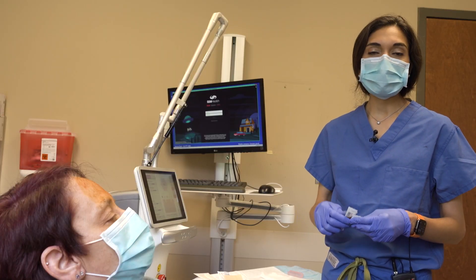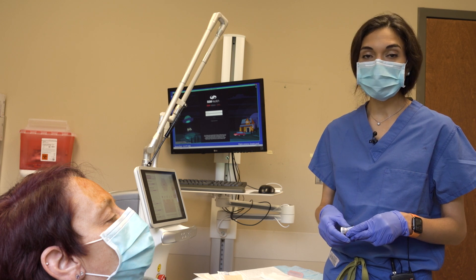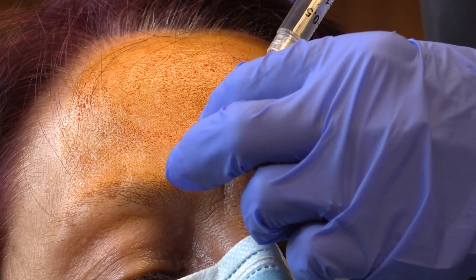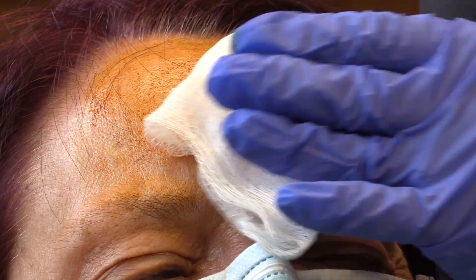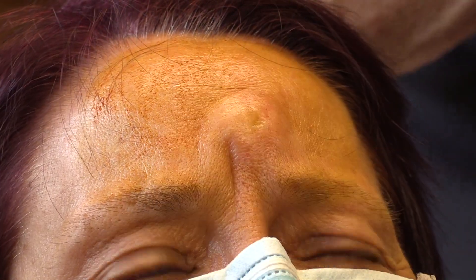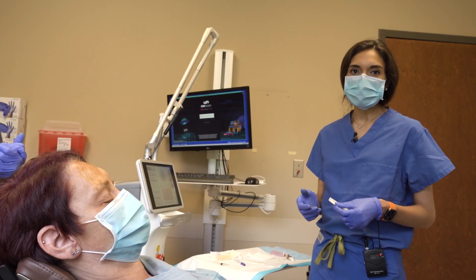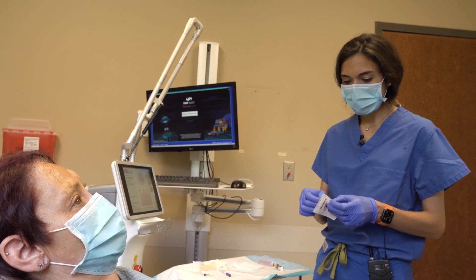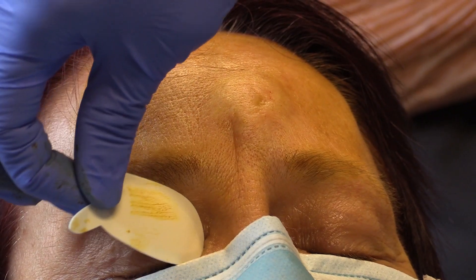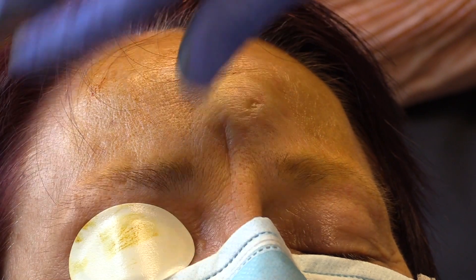The next step is to go ahead and numb the skin, which is required for the laser to be a comfortable procedure. The laser itself is very, very safe. One of the uncommon side effects though is damage to the eye, and so because of that, we do use eye protection both for the patient and the physician.